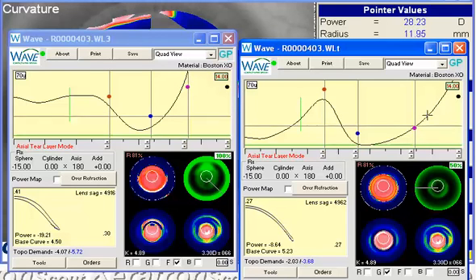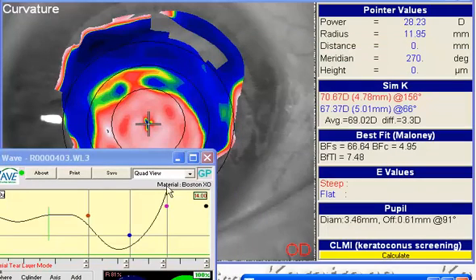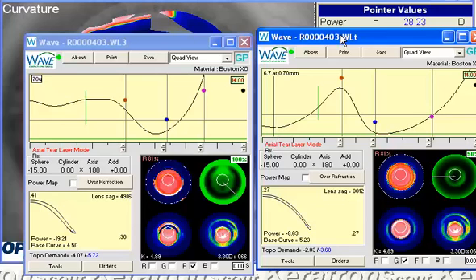Keep in mind this peripheral area is landing out here on the sclera. Go back here to your picture. The peripheral curve is landing out here in the sclera, and then you're going to have kind of a flatter area that lands in here. It's going to vault over this area, then land in this cornea in the top, leaving this bit of a gap out here. It collects bubbles. So I would probably use a similar design on the left lens, more the free form.